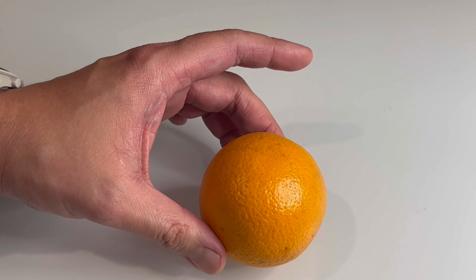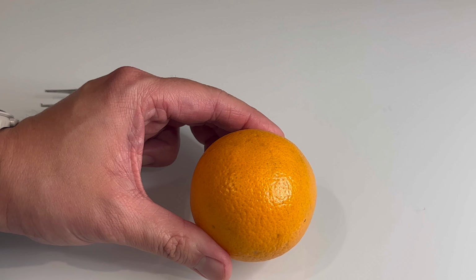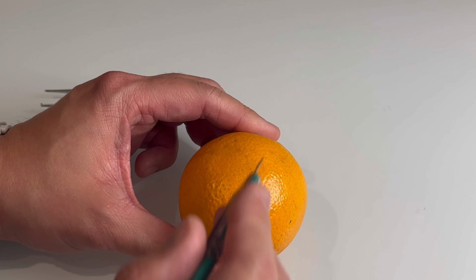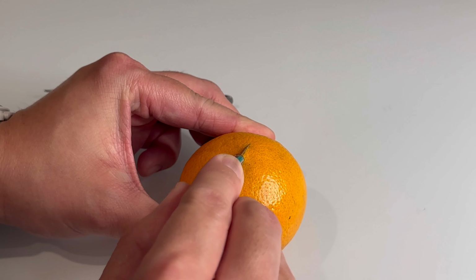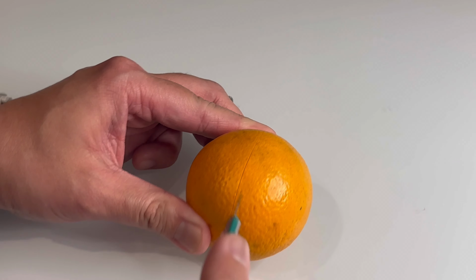Here, we're actually going to start with cutting the orange. And what this will actually show you are different layers, and you could call it the anatomy of the orange. And so when we cut it, we're cutting the skin of the orange. From there, you could see it going down pretty well.